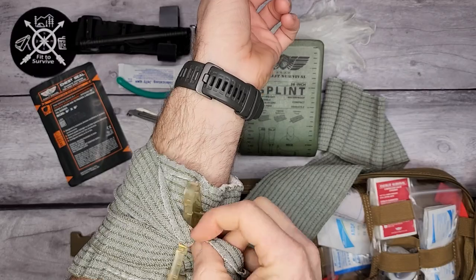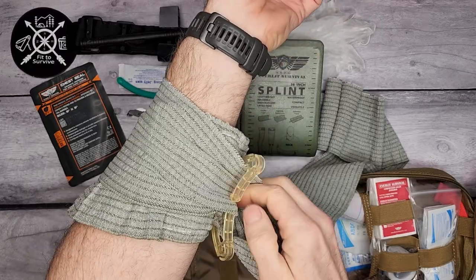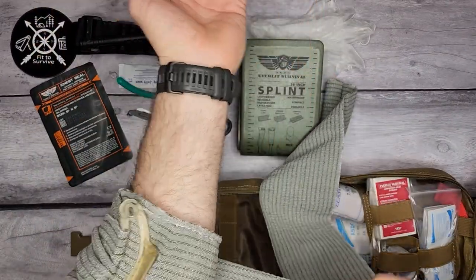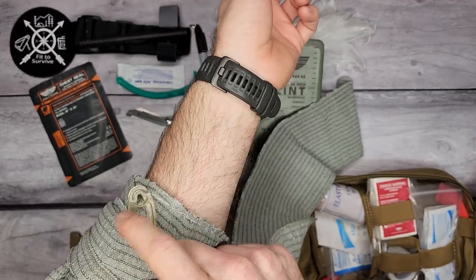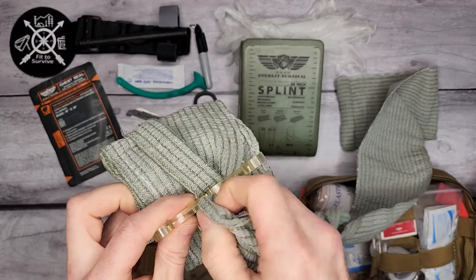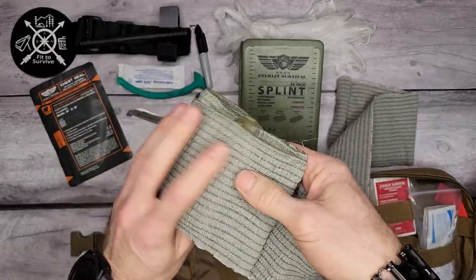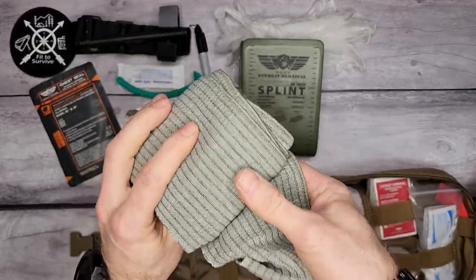You thread the bandage through the little plastic piece and go back, which applies pressure right to that exact location. You wrap around as many times as needed and then snag it back underneath the white plastic section to lock it in place. This is an important thing to carry — it does really well for stopping bleeds. It doesn't apply as much pressure as a tourniquet, so it's not going to stop blood flow to the lower extremities, but it will apply pressure to the wound to help stop a serious bleed.